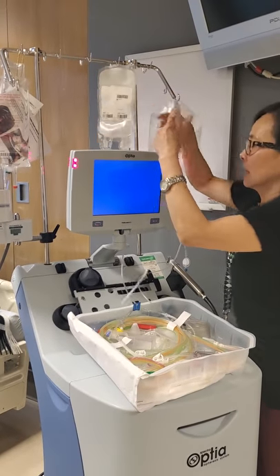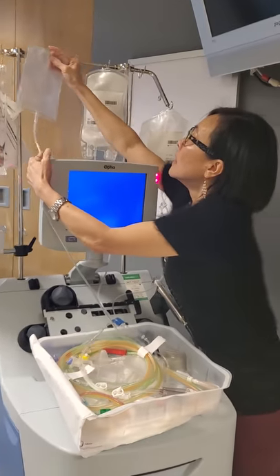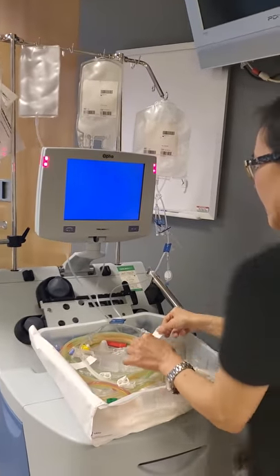Where does the vent bag go? It comes this way, it comes off the left side, and it hangs on the corner too. Very good.